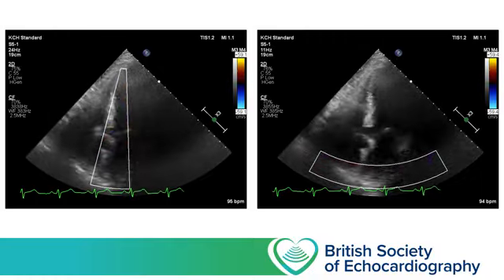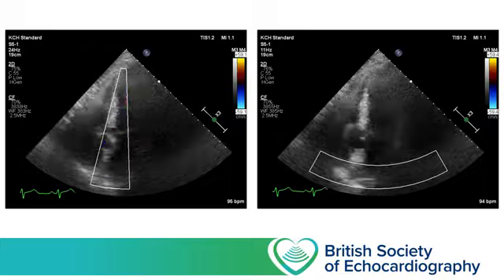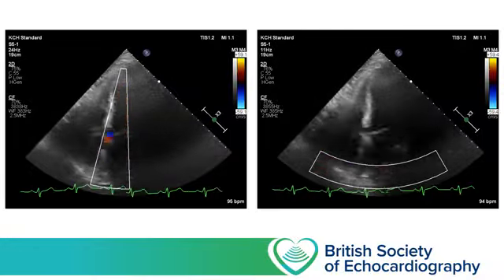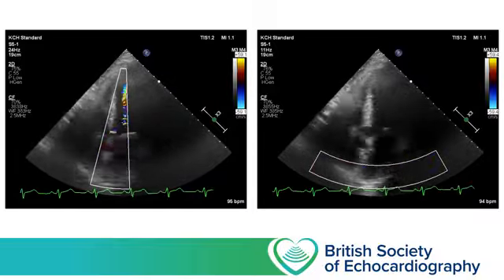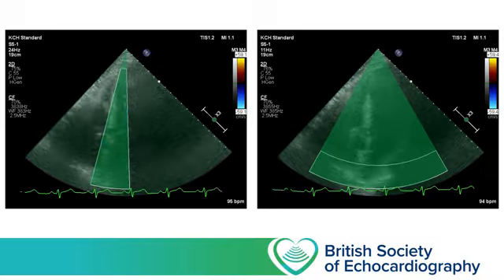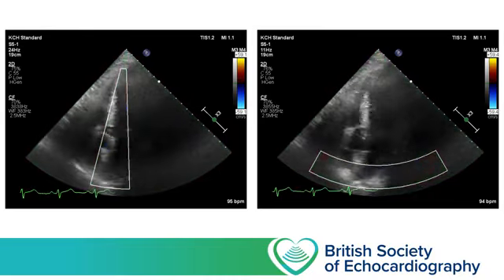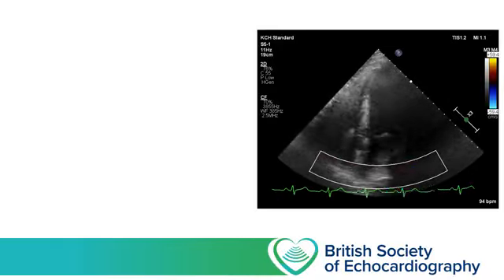Let's take a quick look at an exaggerated example which I think will help reinforce this for us. So here we've got two apical 5 chamber views, both with a sector width of about 90 degrees and a depth of 19 centimeters. And both clips have got a colour box on, and roughly speaking the colour box occupies a similar sort of area on the image. But the clip on the left, which has a very narrow colour box, has got a frame rate of 24 frames per second, whereas the clip on the right with a very broad, wide colour box has a frame rate of just 11.